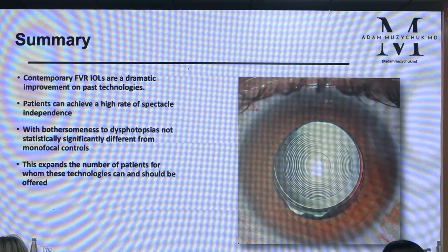Contemporary full visual range IOLs are a dramatic improvement on what we used to have. Patients have a high rate of spectacle independence with bothersomeness. So the frequency and severity is higher, but the bothersomeness of dysphotopsias was not statistically significantly different from monofocal controls between months 4 and 6. That's when we checked it.